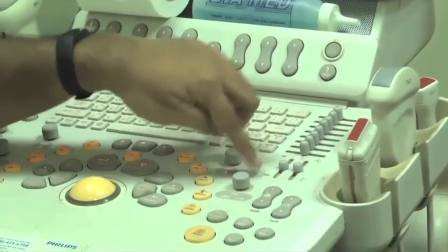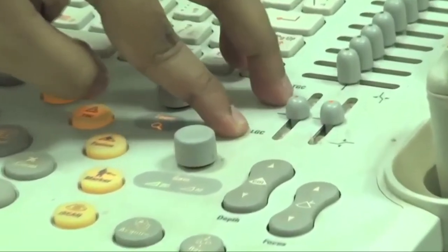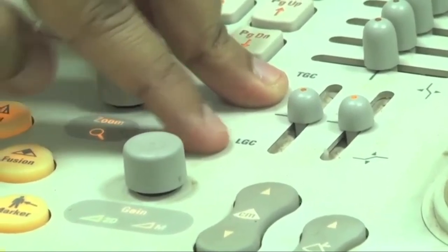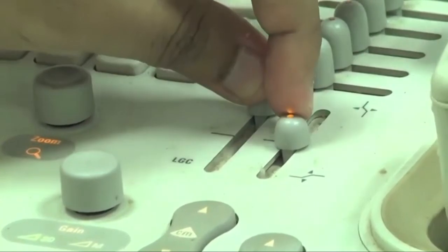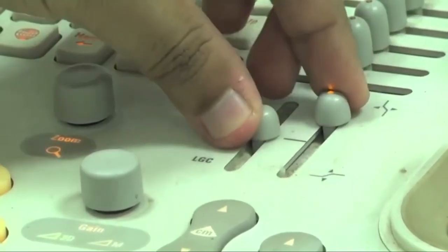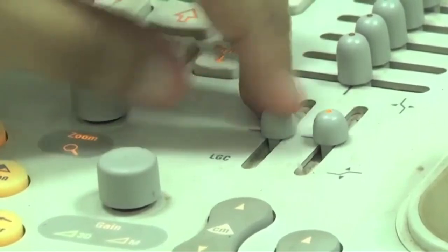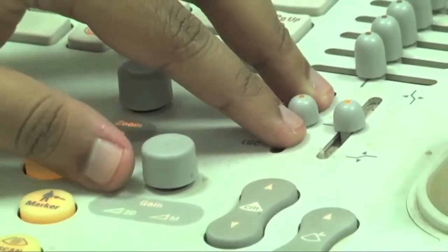The other one which I would show you is called LGC, or lateral gain compensation. This compensates for the left-right kind of loss. Say I want to amplify the signals coming from the left hand side and attenuate signals coming from the right hand side. I can make those changes here. In general, we keep both sides at unity amplification, and only in very specific cases do we use very selective amplification.